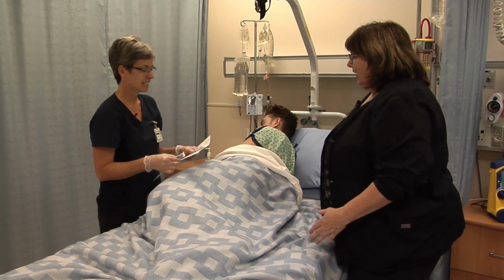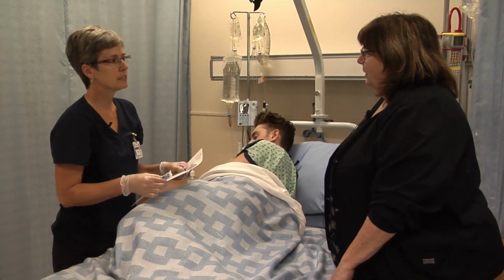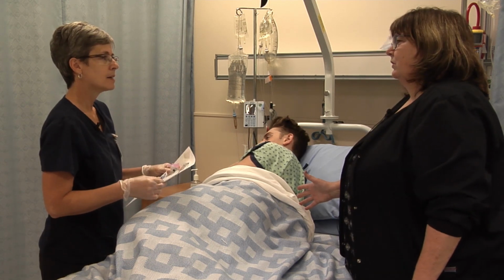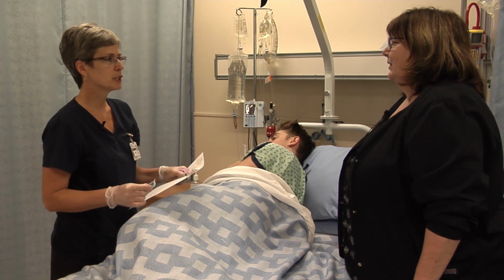So we're going to do another IM, but using another site. What's this one called? This one's called ventrogluteal. It's the side, the muscle on the side of your hip. We used to do dorsal gluteal. Do we do that one anymore? Yeah, way back in the day. So now we're aging ourselves.